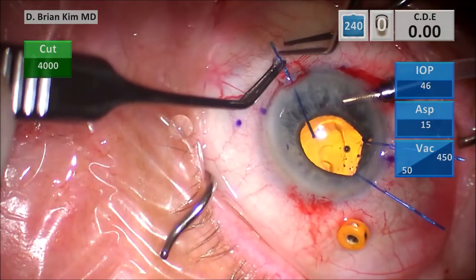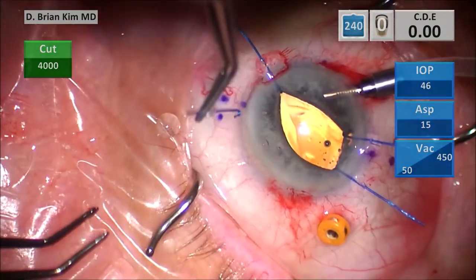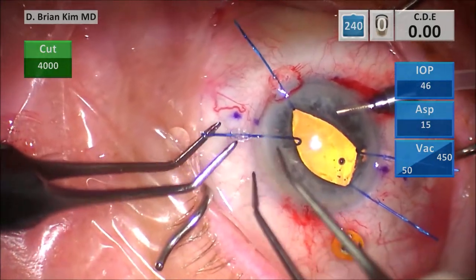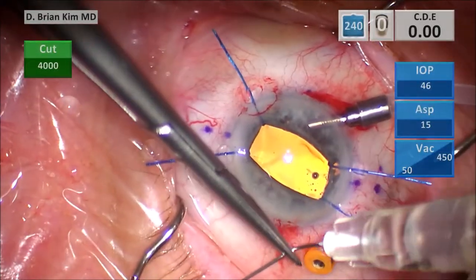You hook it and then push the stopper down — not difficult to do, but it is one extra step. In cases like this you don't really have a lot of margin for error; you want to execute the surgery as perfectly as you can. This is the right-side needle — I'm bending it about 9 millimeters from the tip.